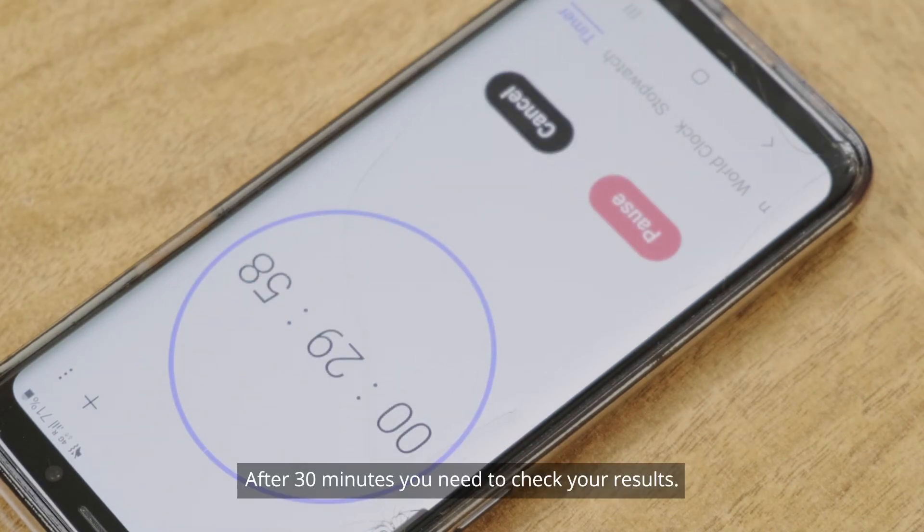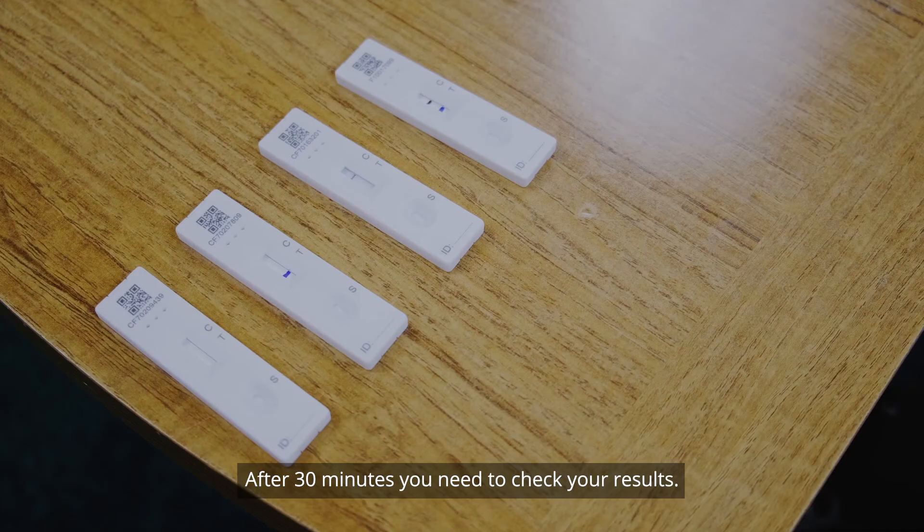After 30 minutes, you need to check your results. There are three possible outcomes for this test.